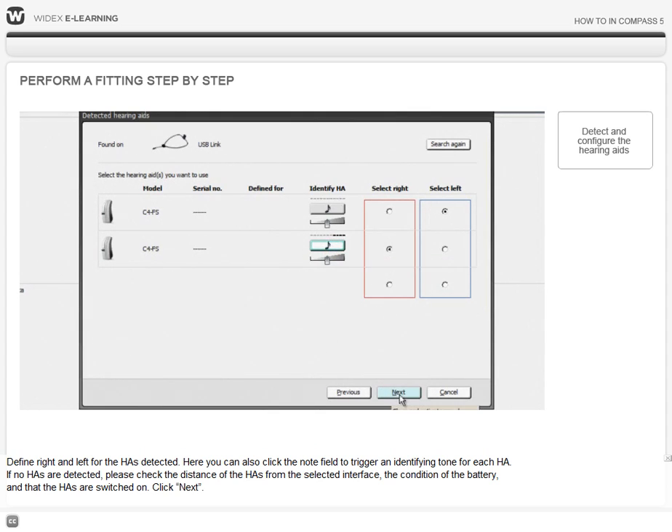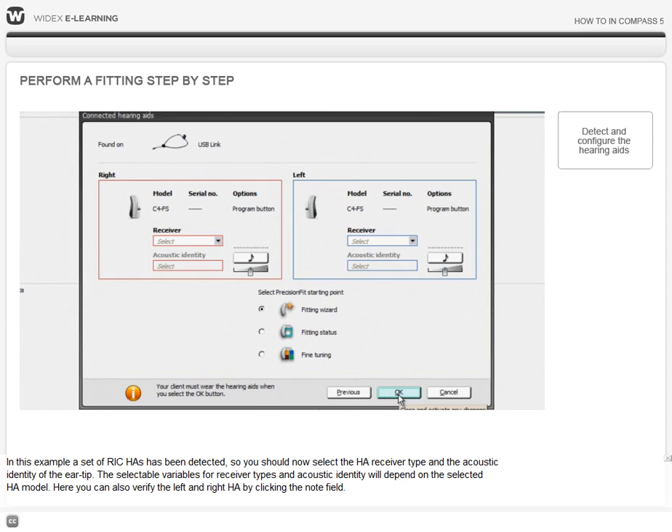Click Next. In this example, a set of receiver in canal hearing aids have been detected, so you should select the hearing aid receiver type and the acoustic identity of the ear tip. The selectable variables for receiver types and acoustic identity will depend on the selected hearing aid model. Here you can also verify the left and right hearing aid by clicking the note field.